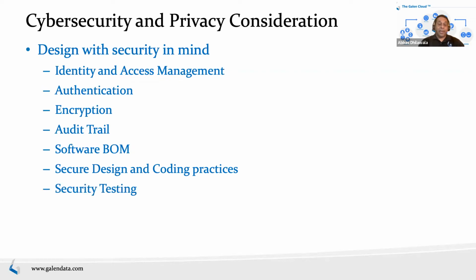And then security testing. Test for security early on, just as you do functional testing, electrical testing, mechanical testing. Do software security testing, penetration testing, and vulnerability scanners, things like that. A lot of good tools are available, free and paid, that will allow you to do these. And eventually, depending on the risk, you may also want to consider independent software consultants that can do this testing for you, especially if you have cloud-based aspects, or if you have remote functions that are controlling your devices, or firmware updates that are happening. You want to make sure those are not being compromised in any way.